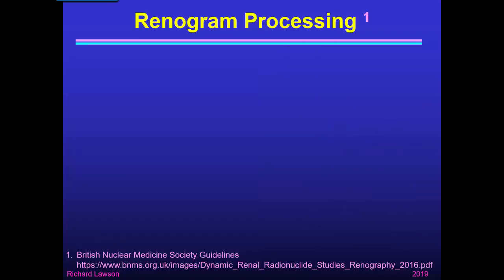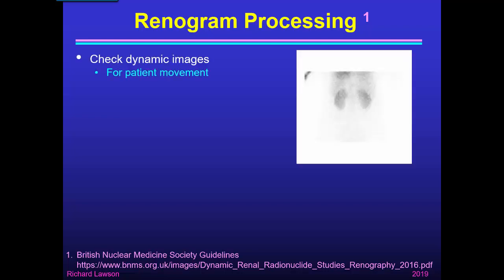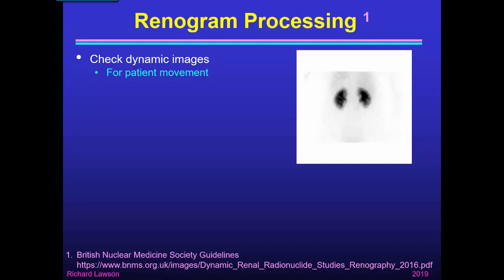The steps in renogram processing depend on the nuclear medicine system being used. The basic steps described here follow the guideline from the British Nuclear Medicine Society, though individual computer procedures may differ slightly. We start by checking the dynamic images acquired by the gamma camera — one image every 20 seconds, shown here speeded up — where we can see activity starting in the kidneys, draining down the ureters, and appearing in the bladder. We check the anatomy and verify that the patient didn't move during the study. Then we create a summed image of the full dynamic study to make it easier to draw regions of interest.